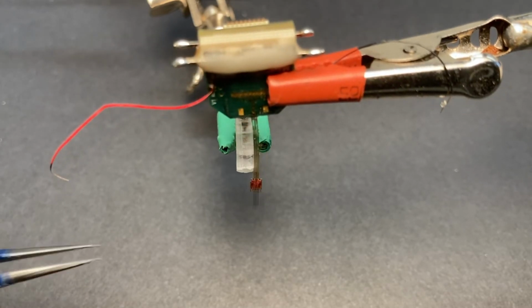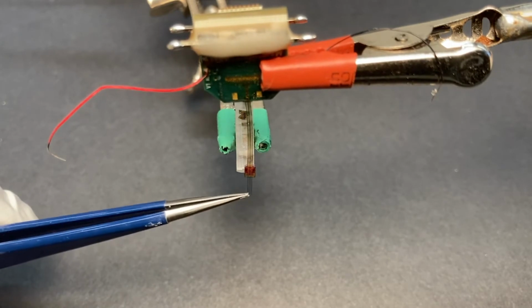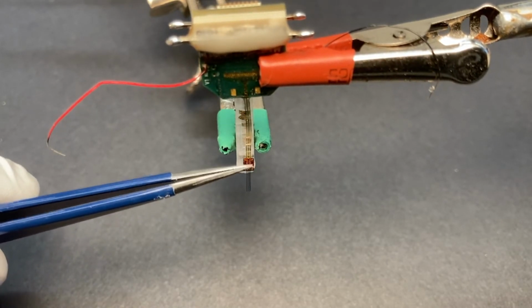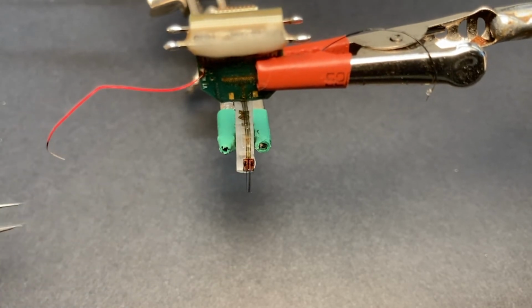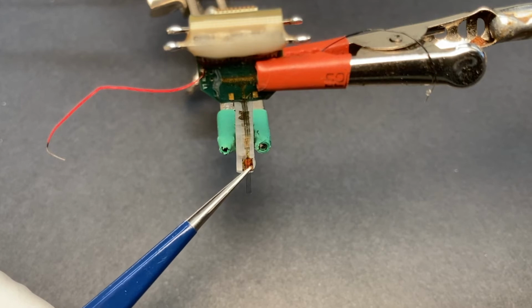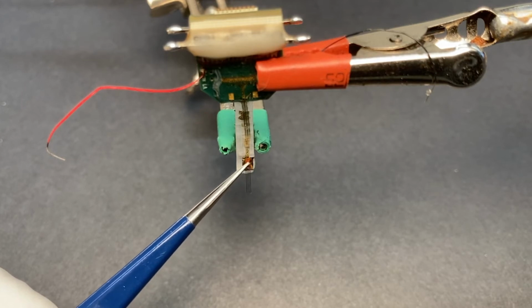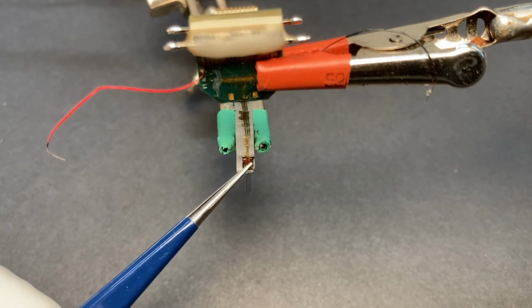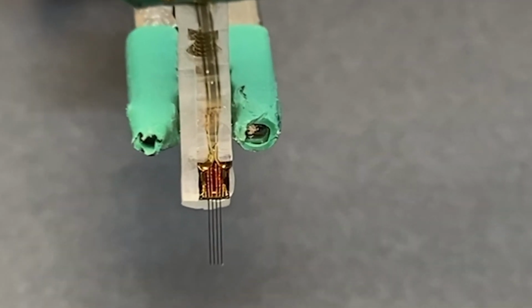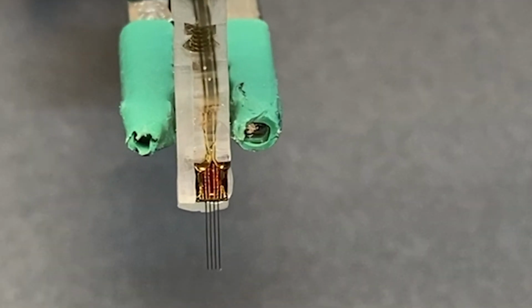And then once the glue is applied, then you can just move in your silicone probe backend, and then using a tweezer, you can just fine adjust the position. And here at the backend, there is a tiny layer of epoxy, so you can feel free to gently touch it, but be extremely careful, but this is a safe spot to touch. So, and then once you oriented your probe backend with the drive, then you can let the glue cure.